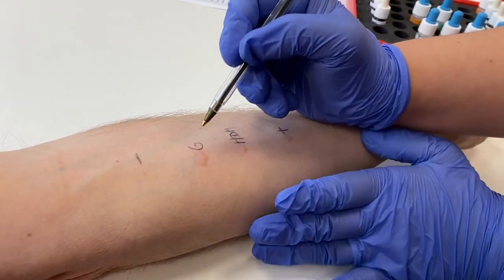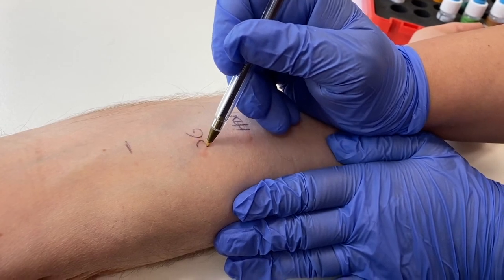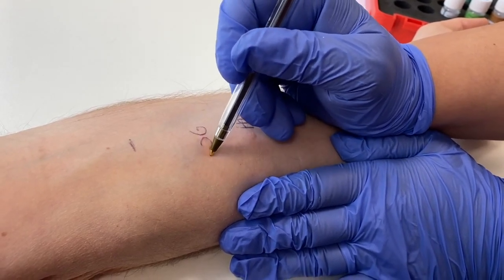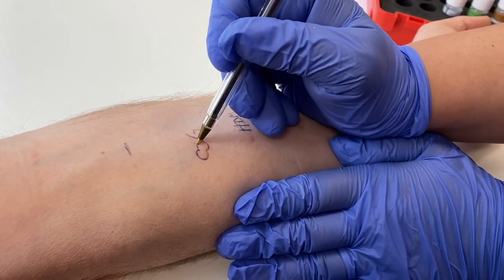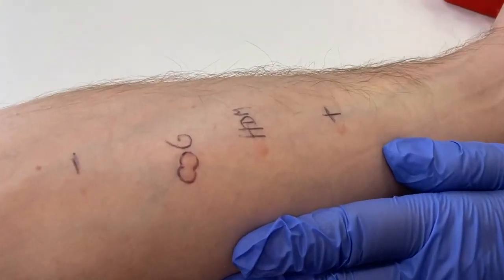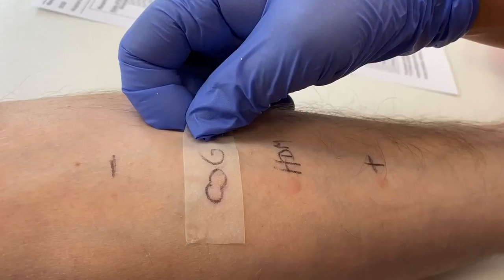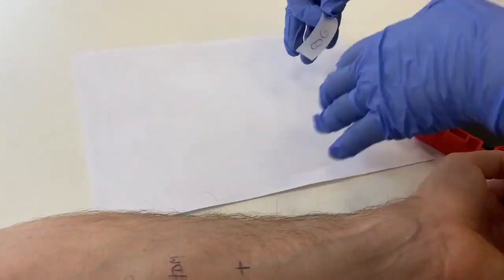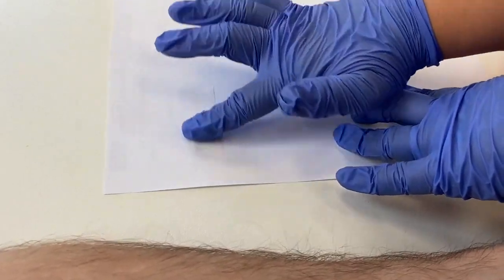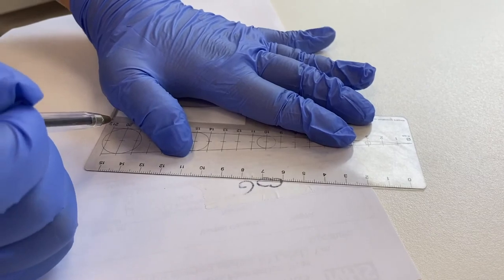To record the degree of the reaction, it can be useful to draw around the wheal to document the exact size in the clinical notes and to aid accurate measurement. Here, Alex is drawing around the wheal with a biro — in clinical practice that isn't always done, but it is often done in research studies. Alex then applies a tape and gently rubs it onto the skin, before lifting it off and sticking it onto the paper notes, where the biro mark is transferred. Once the mark has been transferred to the paper notes, it can be measured.